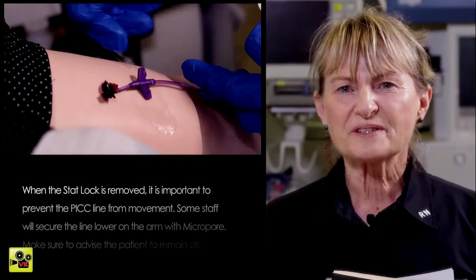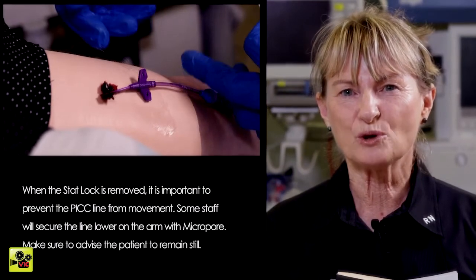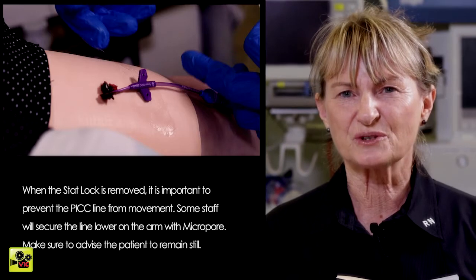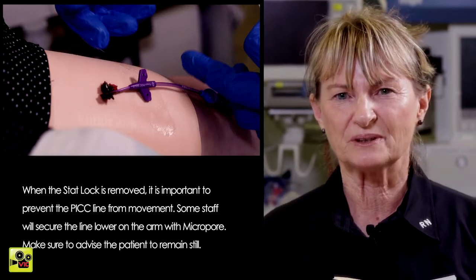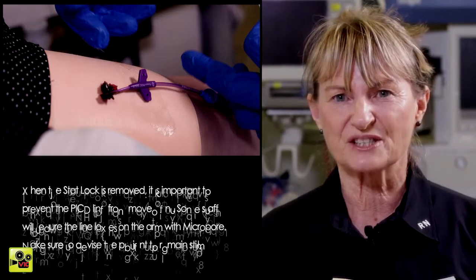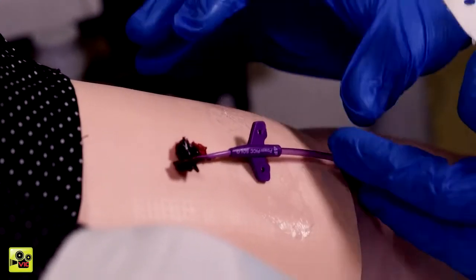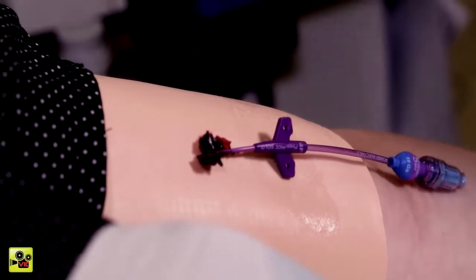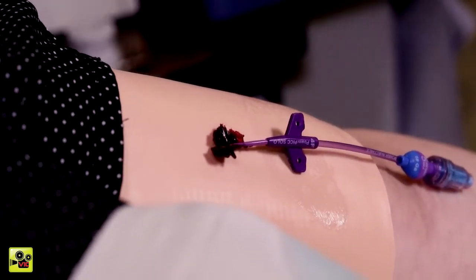Thank you. When the stat lock is removed, it is important to prevent the PICC line from moving. Some staff will secure the line on the arm with micropore. Make sure you advise the patient to remain still. Okay, now just leave your arm nice and still now. Try not to move it at all. Okay. I'm just going to go and wash my hands and then we'll get the dressing done.